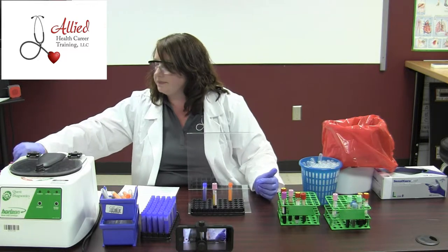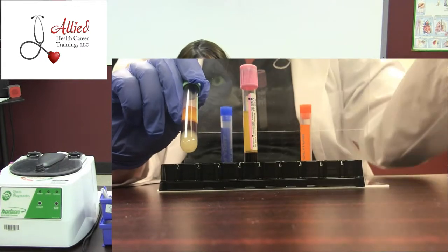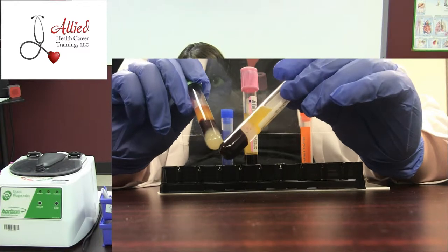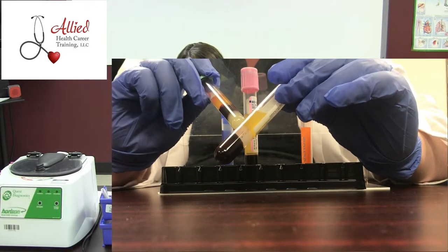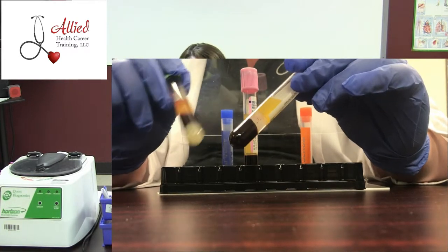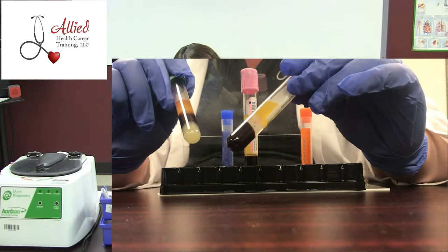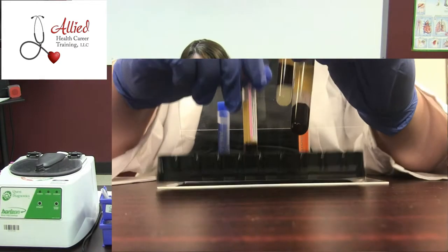See how there's a gel barrier here? What happens once you centrifuge is those red blood cells pull it up to the middle, and it will separate your serum from your red blood cells. These tubes are known as serum separator tubes. You can also have a plasma separator tube. Not all tubes are equipped with that — if you notice, this pink one is not.